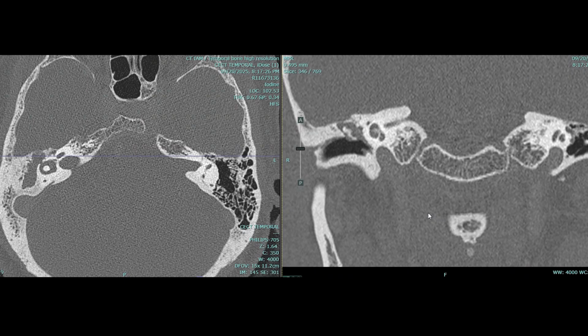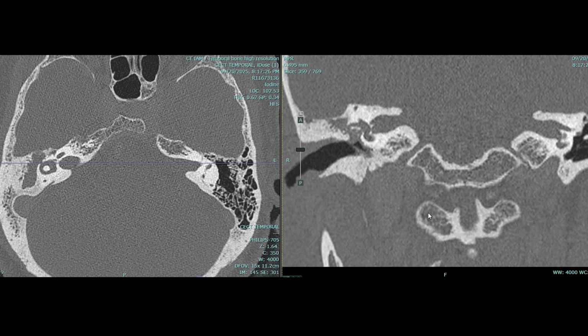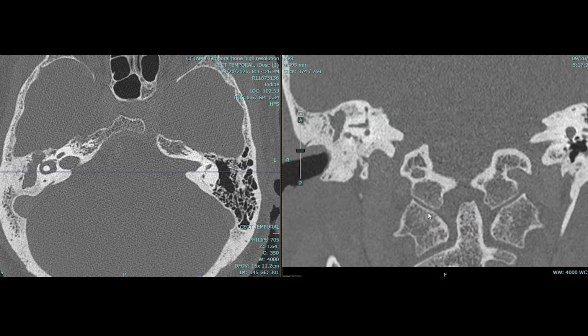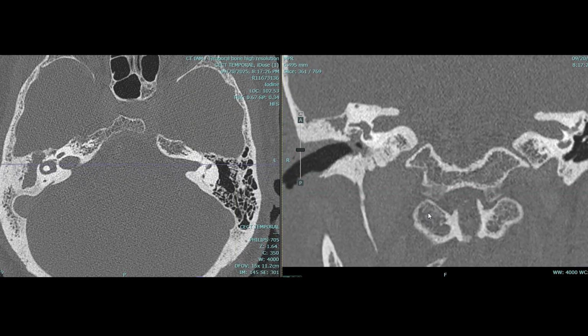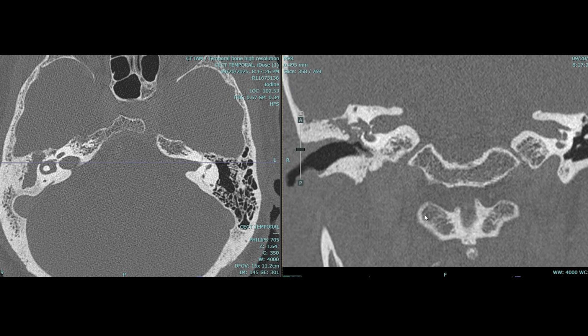This patient presented in the emergency with a previous history of ear discharge lasting years, coupled with recent acute onset of vertigo for the past few days, and coupled with severe progressive hearing loss in the similar duration of past few days as well. On examination, one could see a large central perforation, but on endoscopic examination, the presence of an attic pathology was duly noted.